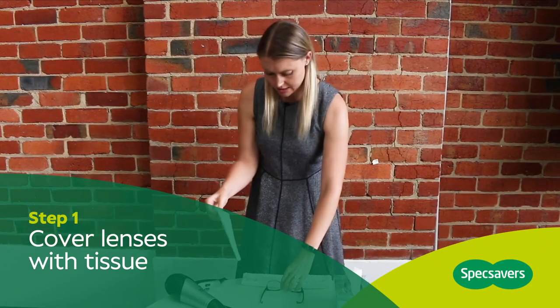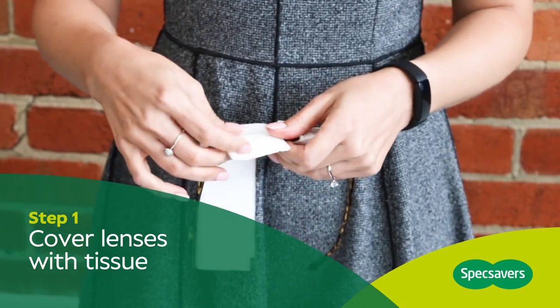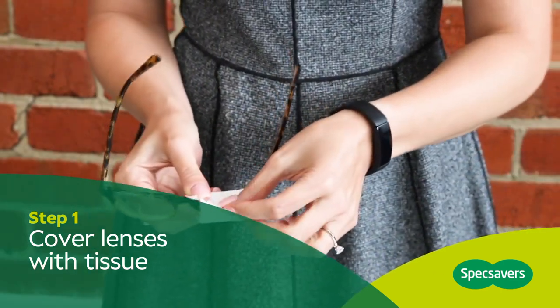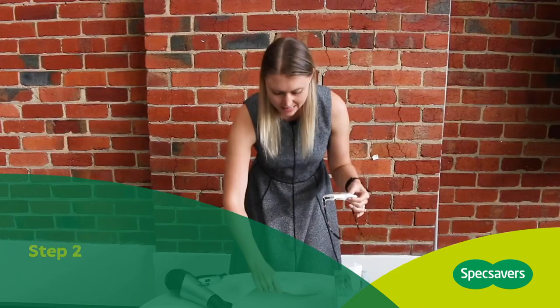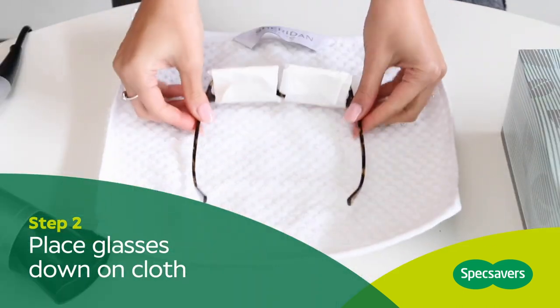Get some tissue that you've folded and cover the first lens. Once you put the tissue all around the lens, you can secure it with some sellotape. So that you don't damage your kitchen counter, place the glasses on a nice soft towel.